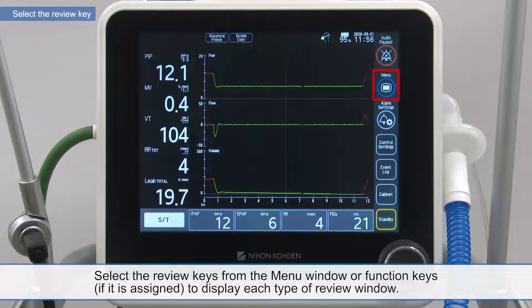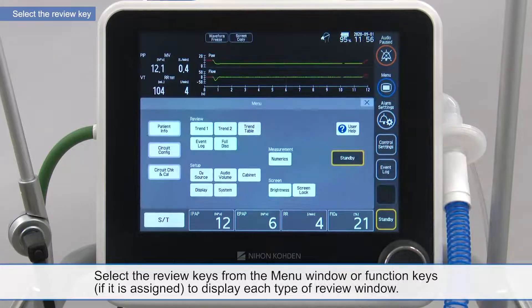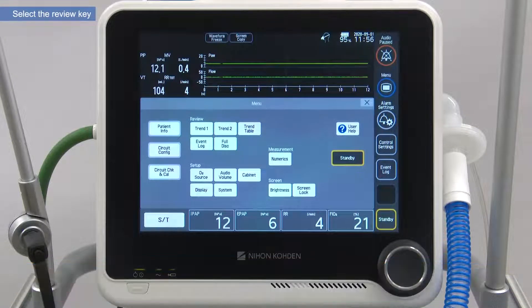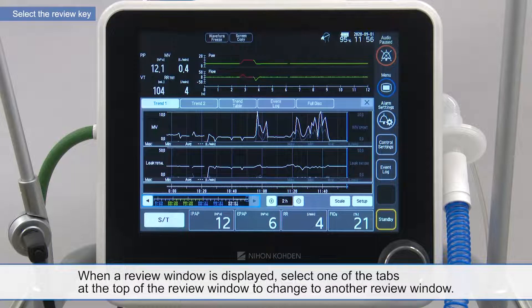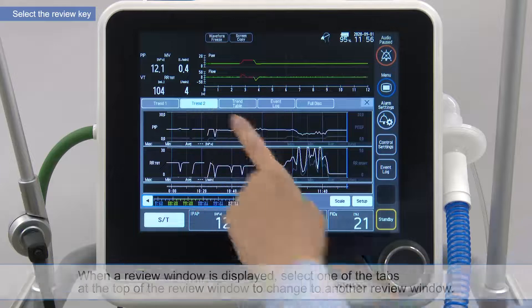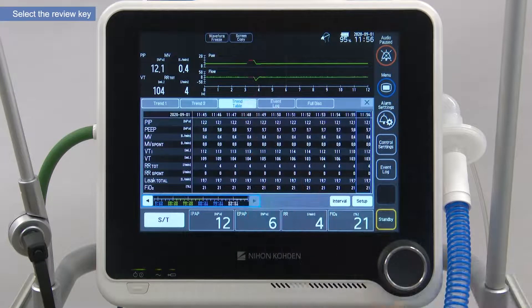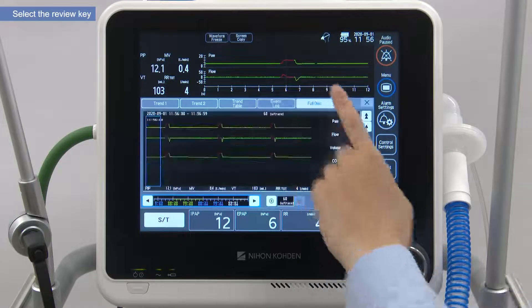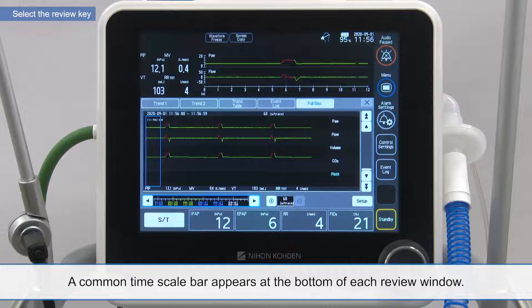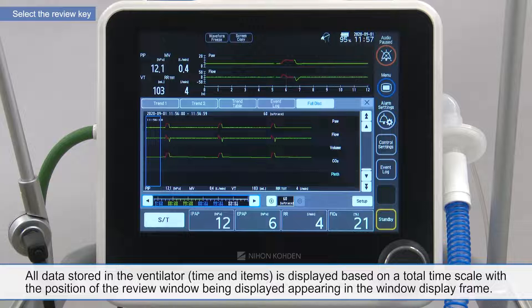Select the review keys from the menu window or function keys to display each type of review window. When a review window is displayed, select one of the tabs at the top of the review window to change to another review window. A common time scale bar appears at the bottom of each review window. All data stored in the ventilator is displayed based on a total time scale, with the positions of the review window being displayed appearing in the window display frame.